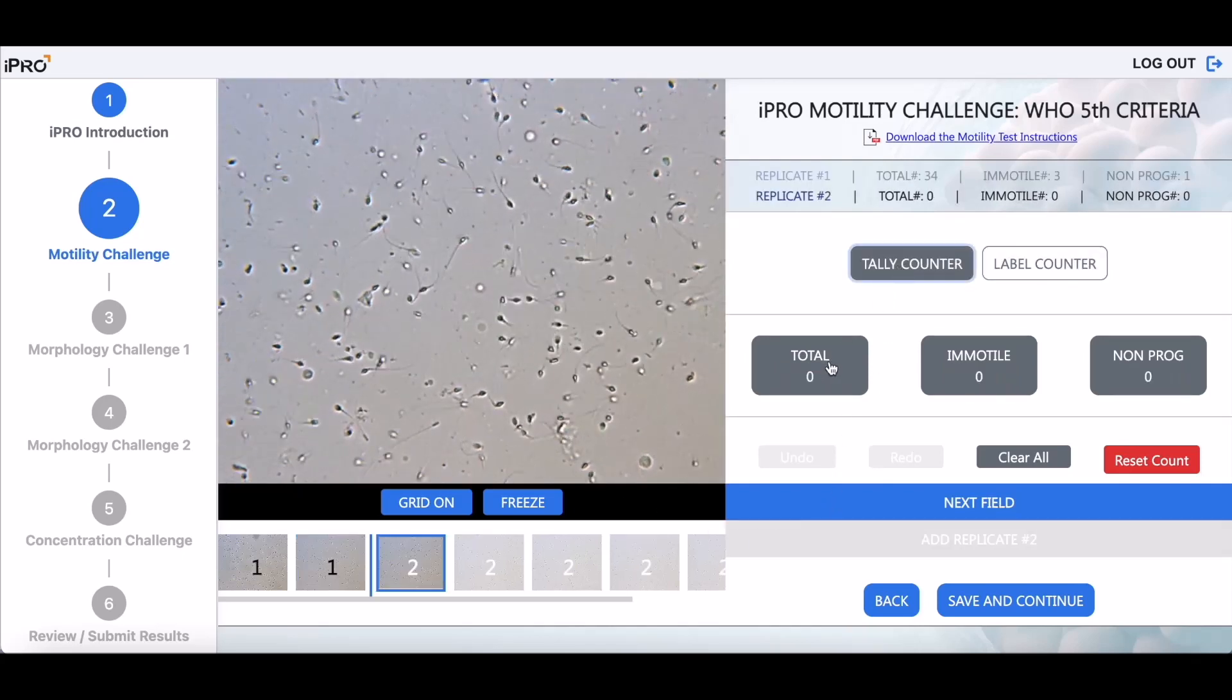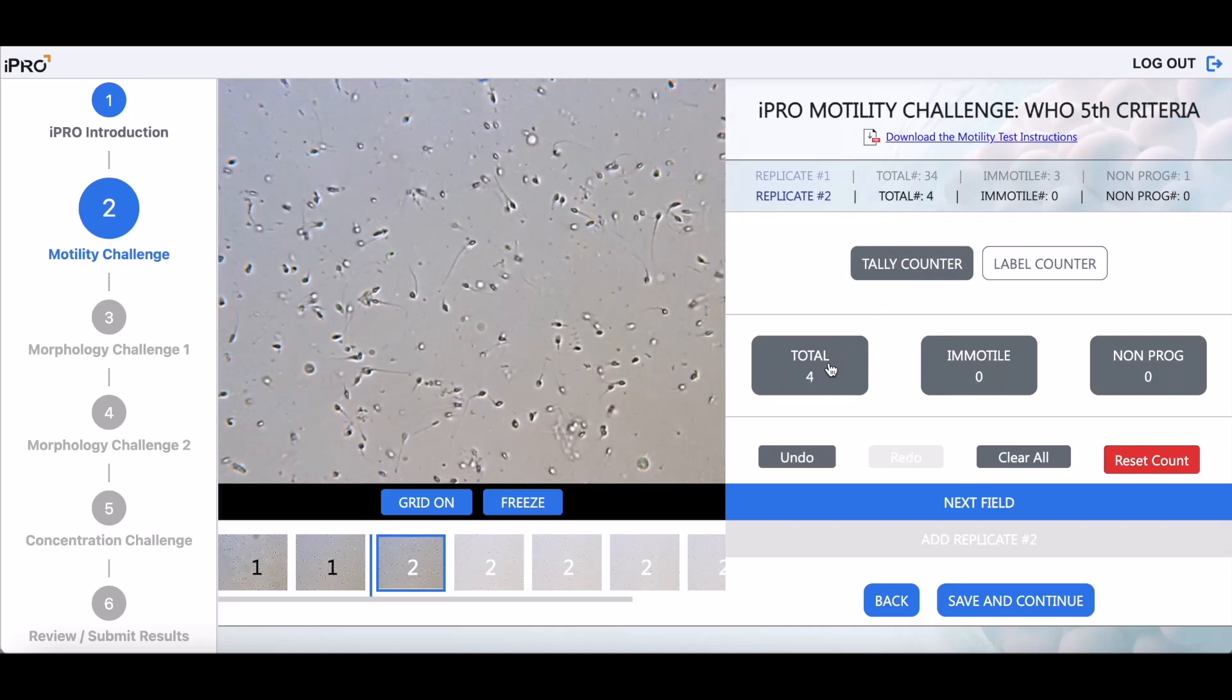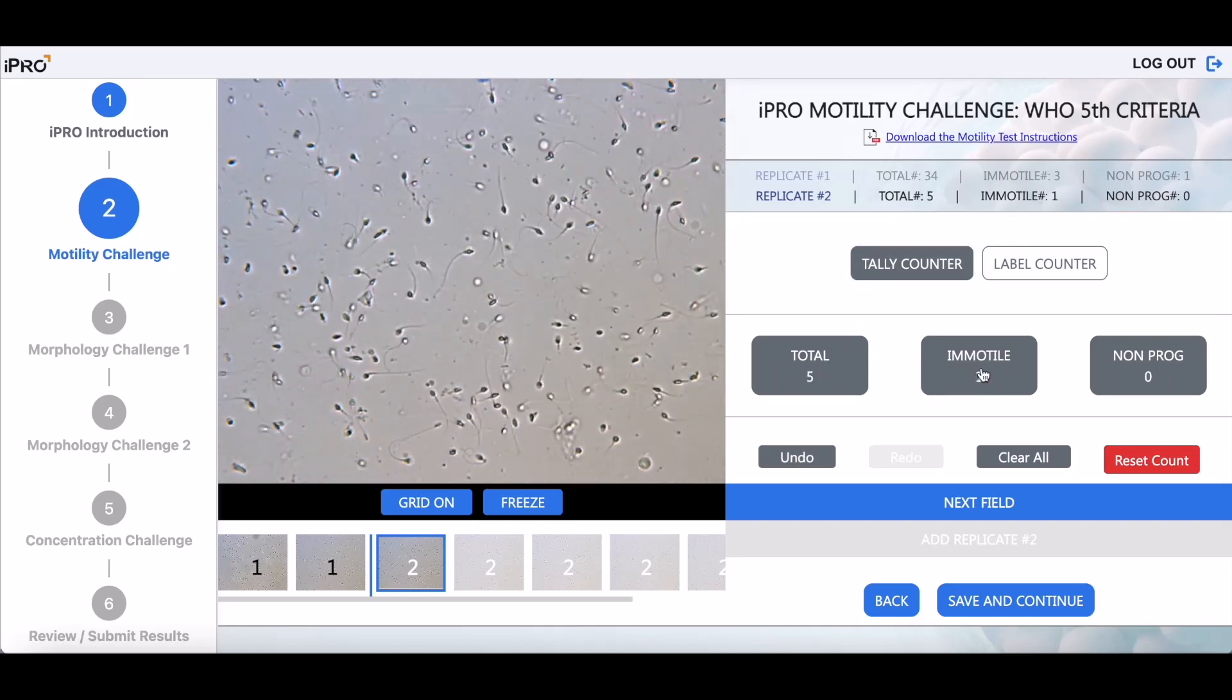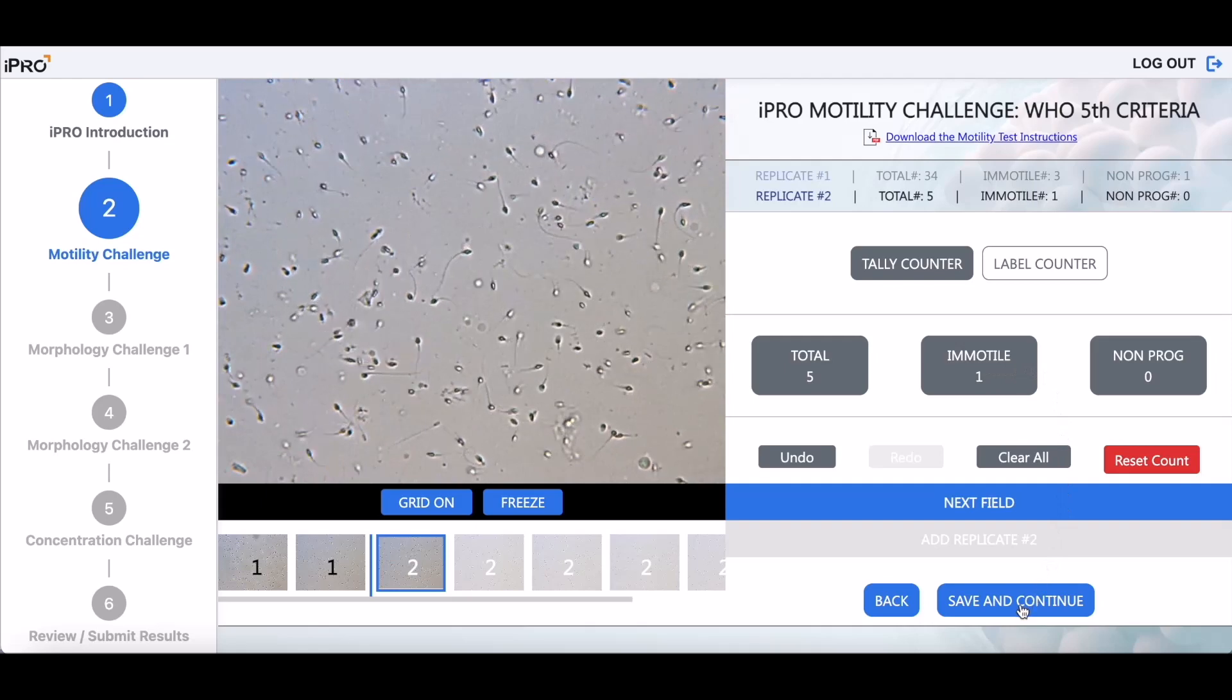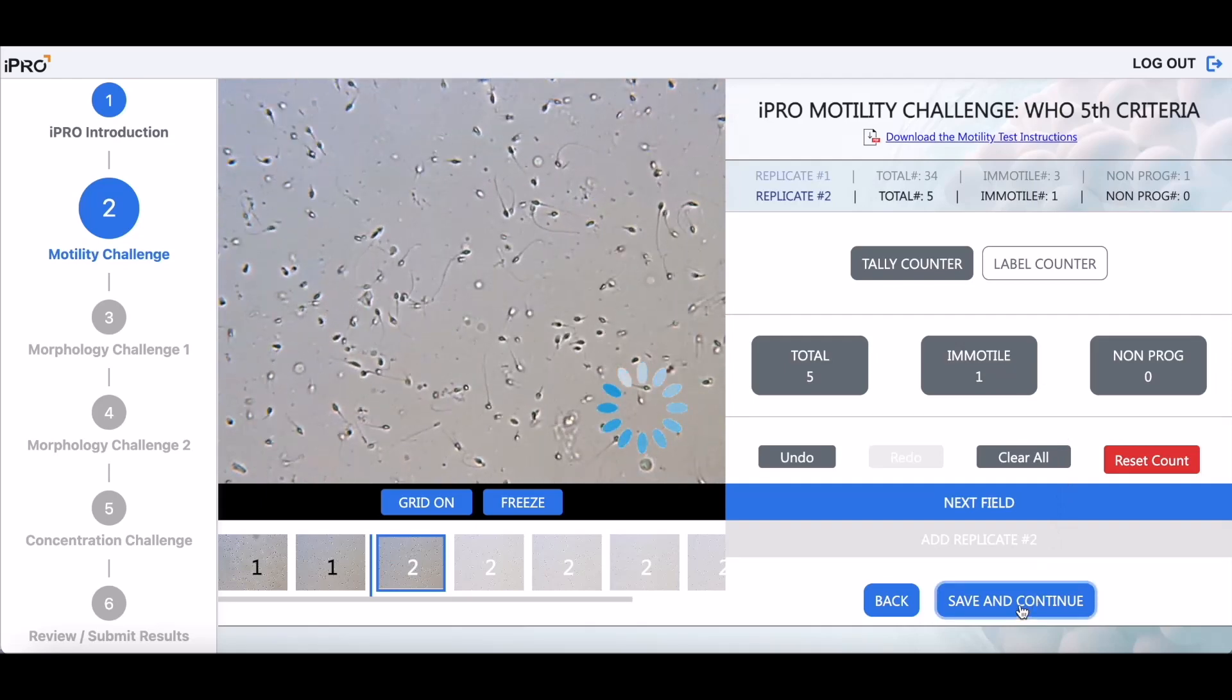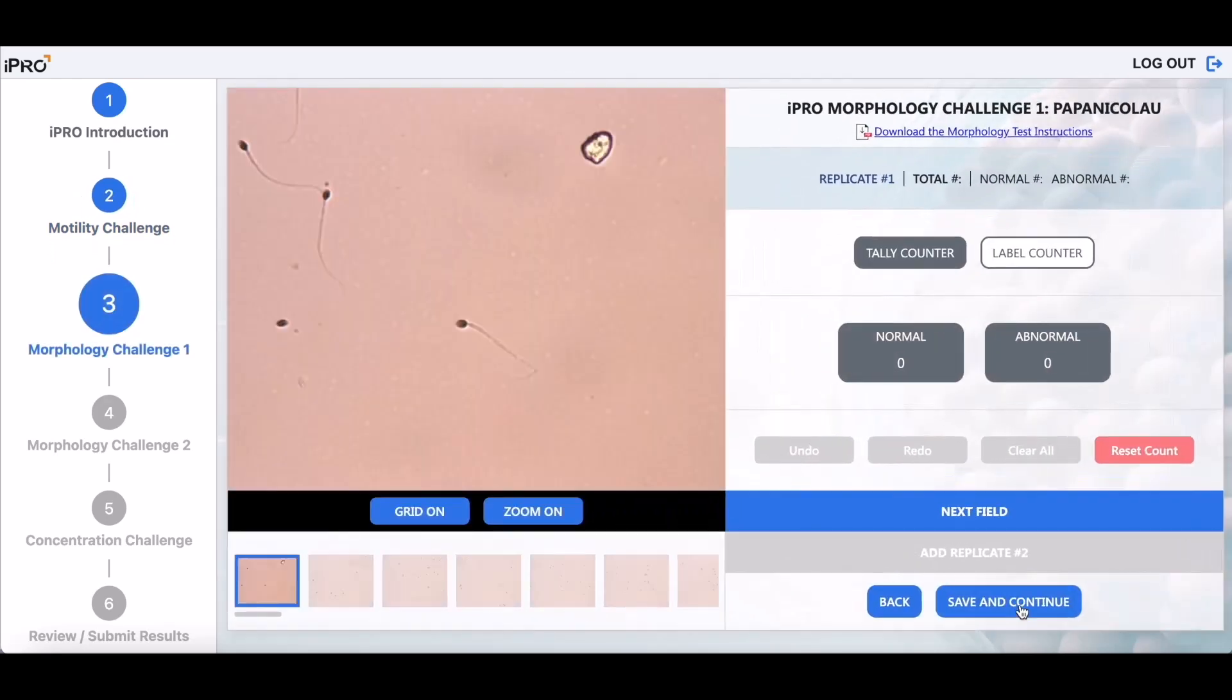Add the second replicate and begin counting. The WHO guidelines recommend counting 200 sperm cells twice using two replicates. Click Save and Continue to automatically save your results to your account. You can then complete testing at another time.